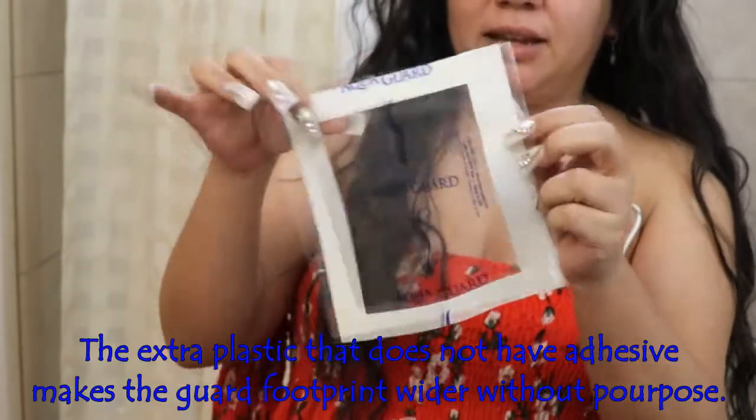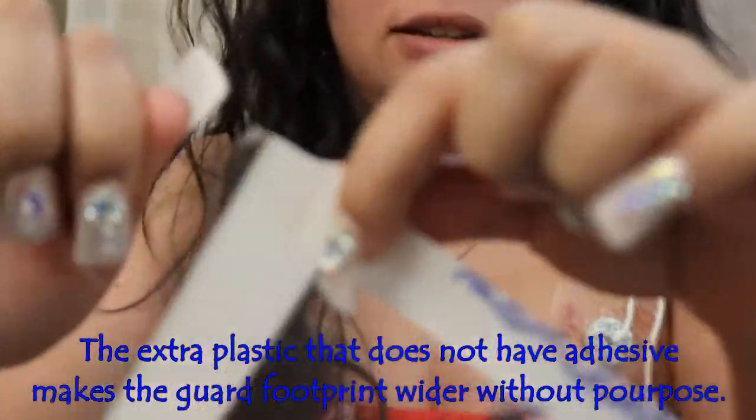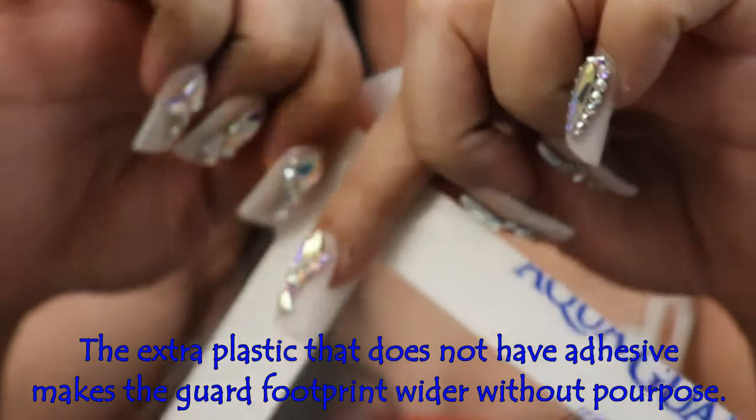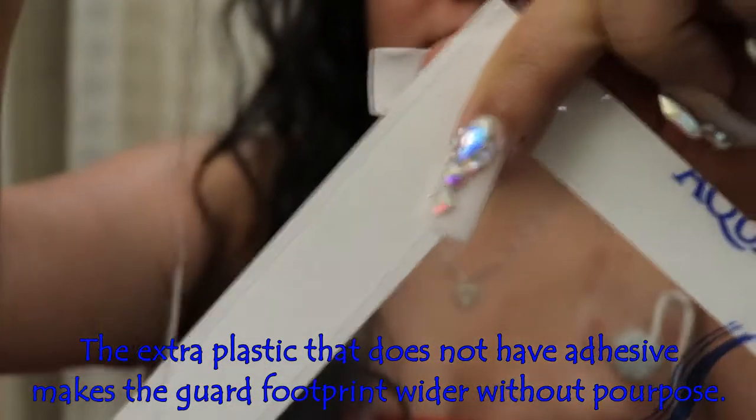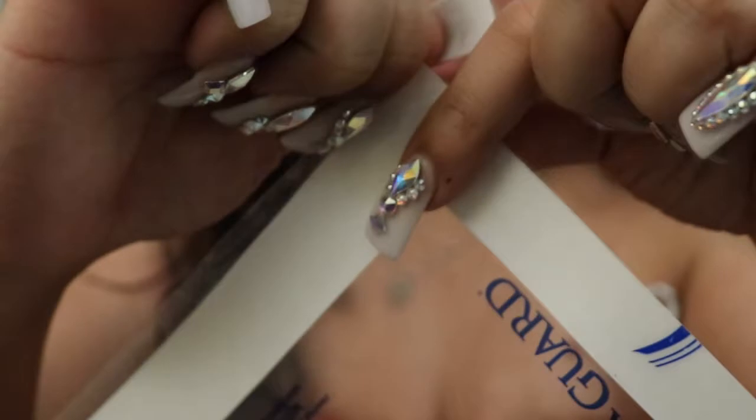But yeah, let me just go ahead and jump in and show you guys what I do to cover this port. So the first thing is the AquaGuard, right? I grab the ends and I peel them off because there's a little extra flap there, and what I notice is that extra flap is just a bunch of extra space that I don't need. So I grab it and I pull it.